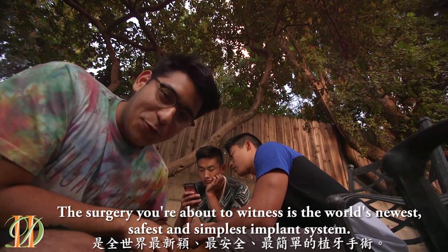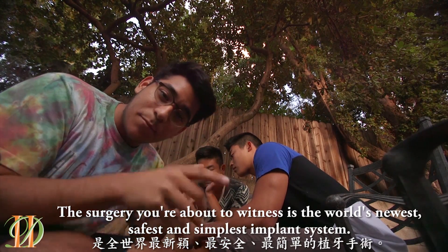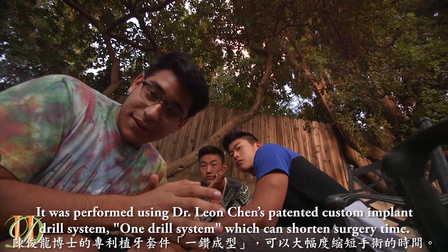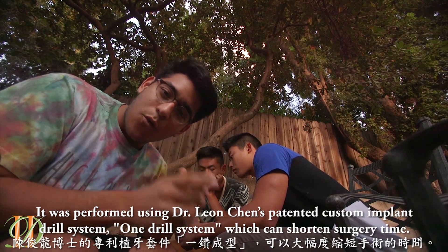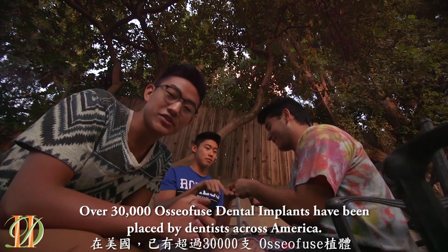The surgery you're about to witness is the world's newest, safest, and simplest implant system. It was performed using Dr. Leon Chen's patented custom implant drill system — one drill system which can shorten surgery time. Over 30,000 Osseofuse dental implants have been placed by dentists across America.